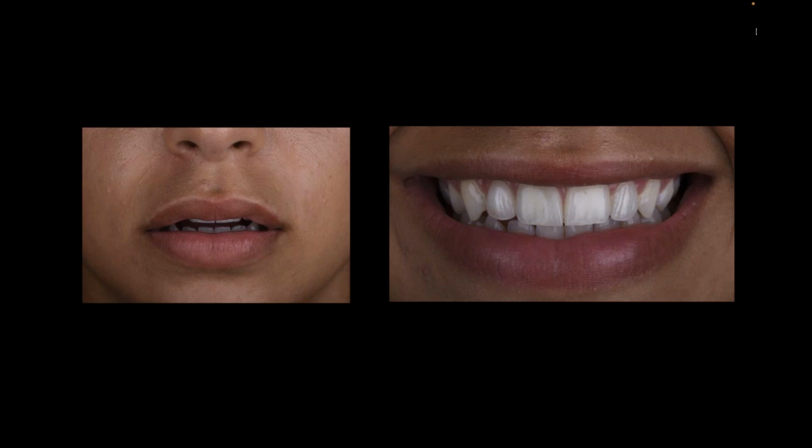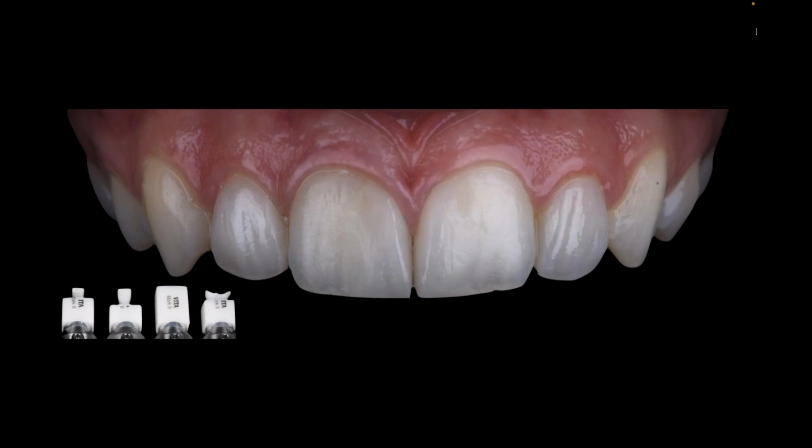So in a case like this, even though the teeth look a little wide, these are just purely milled with a very little tiny bit of stain on them. And this is on the cementation or the bonding. So you can see the tissue hasn't dropped down all the way yet, but this is just on placement. And again, these are no more than 2 to 5/10 of a millimeter. They're just really that one straight material with a little coloration on them. They blend and harmonize so much better.